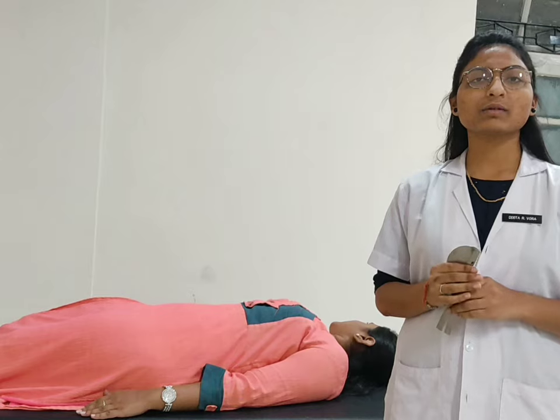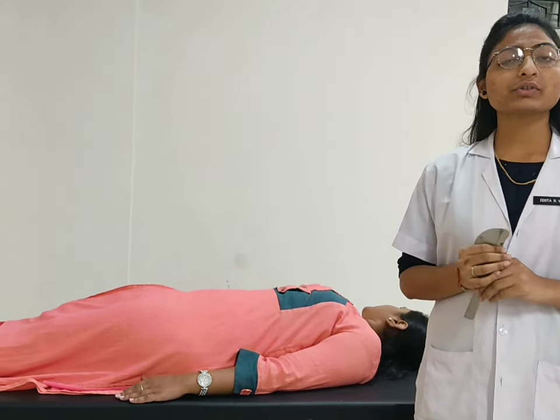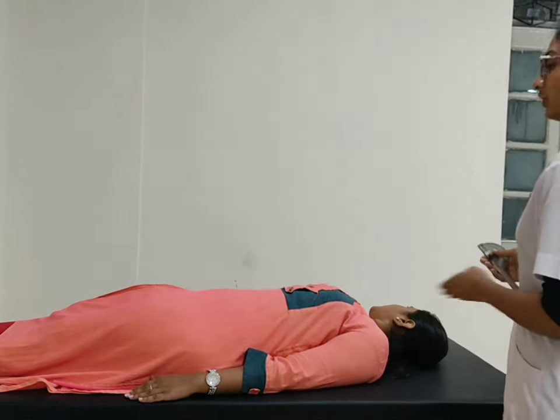Today we are going to discuss about the cutting range of motion with the goniometer. First of all, we are starting with the shoulder flexion. For the shoulder flexion, flexion position.